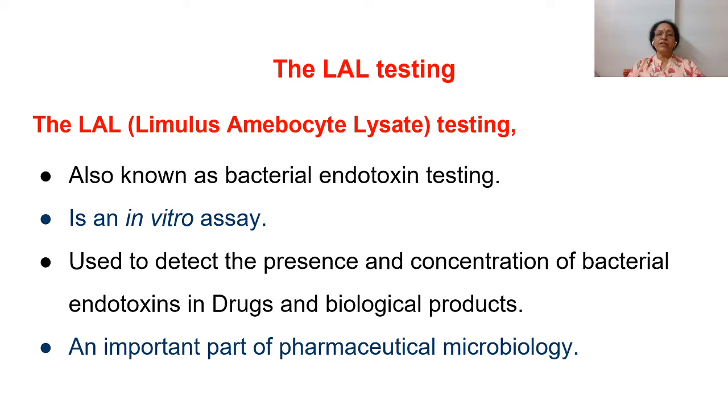This is carried out in the laboratory, that is an in vitro assay, and it is used to detect the presence and concentration of bacterial endotoxins which are present in various pharmaceutical products, as well as certain devices used by the medical industry, like catheters, as well as syringes. This is an important part of pharmaceutical microbiology.